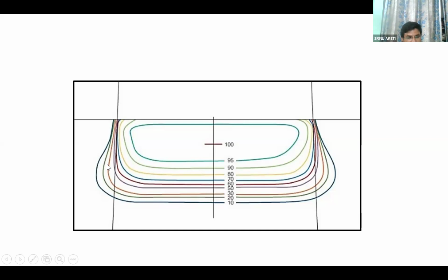Second thing, you talk about these low isodose lines. They are bulged out. I don't know how many people have experience with this. We used to use the photon-electron beam combination while treating head and neck tumors, a few years back, with 3D CRT head and neck. We would treat up to 44 gray in 22 fractions with bilateral fields completely. After 44, in the neck nodes area, to save the spinal cord, we block the spinal cord with the help of jaws or MLC. We need to give less dose to the spinal cord. But if you block it at the posterior border, we have to give electron dose, because electrons will not penetrate much. So the spinal cord will receive very, very less dose.